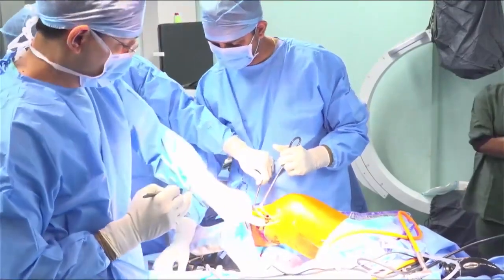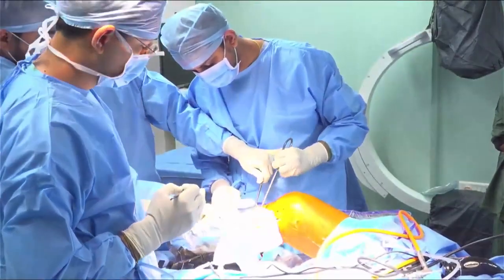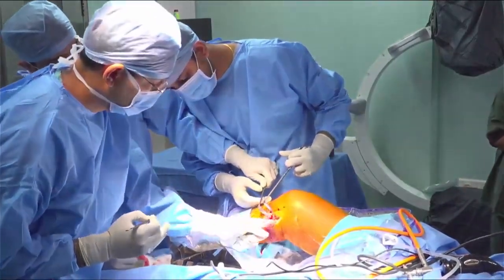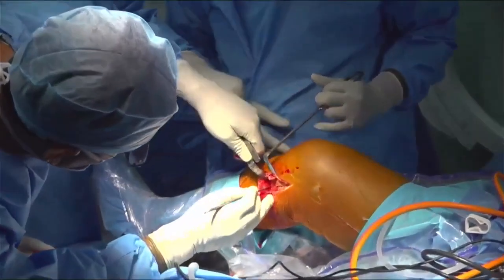So now you can appreciate that the tibial side is totally barren. The tibial side is totally barren. This is basically the MCL which is nibbled over here.